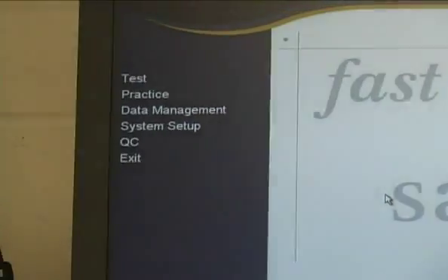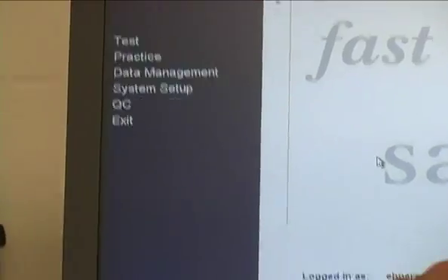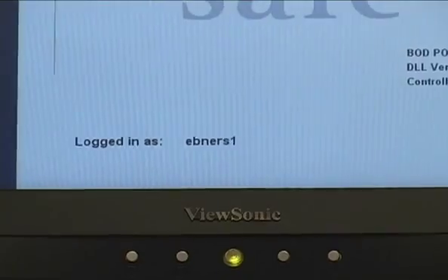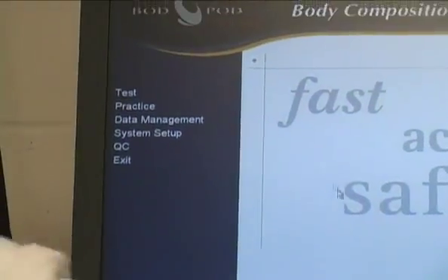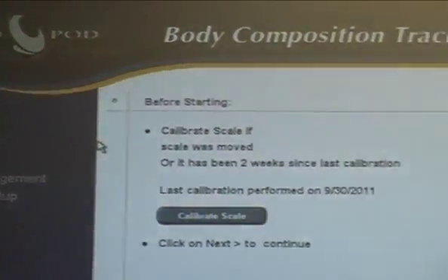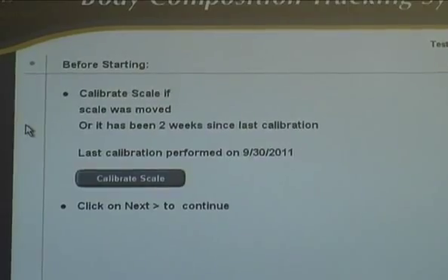Okay. So here you go, a typical Windows menu. It shows login, it shows how Ebony logged in. Until somebody logs out, any test that is done is going to be associated with your name, so you can track and link up records with users and so forth. So we simply go to Test and Body Composition. Here's the first screen, and again, you just read, it's very easy.